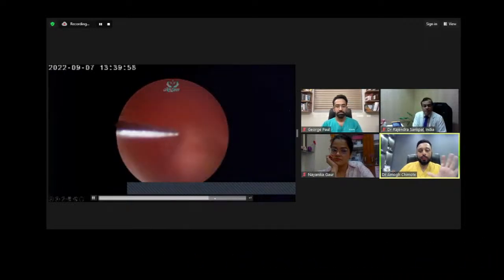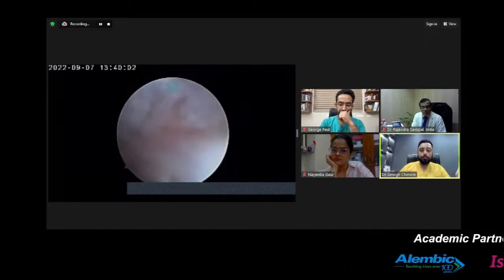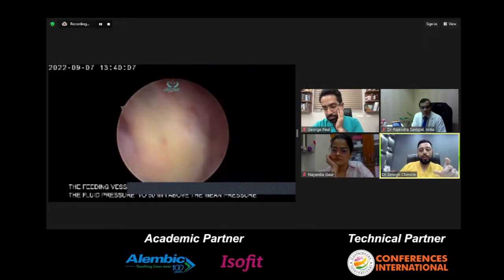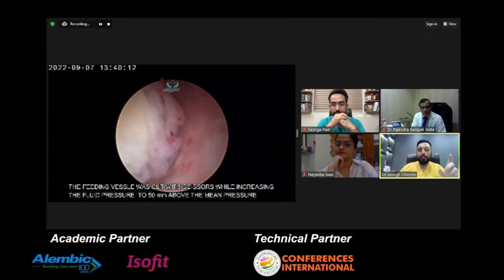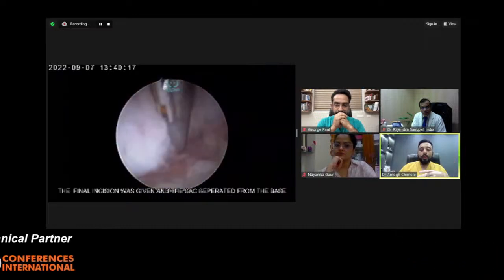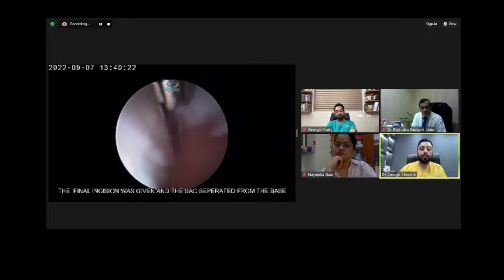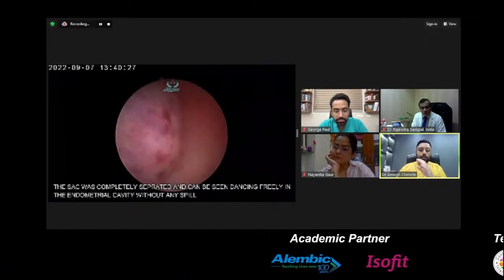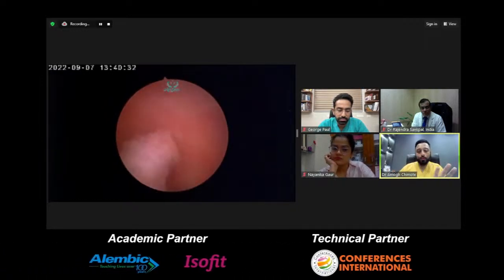As you can see, there was some clouding because of the small blood vessels that were opened up in the process of incision. So I increased the fluid pressure for a brief moment by 50 millimeters of mercury above the mean arterial pressure. This gave me a good vision, and the advantage of increasing the pressure is that you can work faster instead of struggling with a lower pressure and increasing the operating time. You can just increase the pressure, have a good vision, and finish the job.